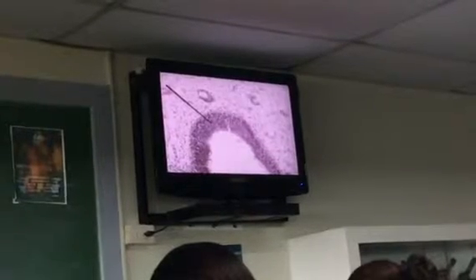Okay, let's look at this under low power. This is low power. Please confirm. There you go. The pseudostratified columnar, if you don't see any goblet cell. In fact, you identify plenty of blood vessels. These are structures with blood within. What I wanted you to identify are structures like this. This is what you call your fila olfactoria or your olfactory filament, which will give rise, of course, to your olfactory nerve.